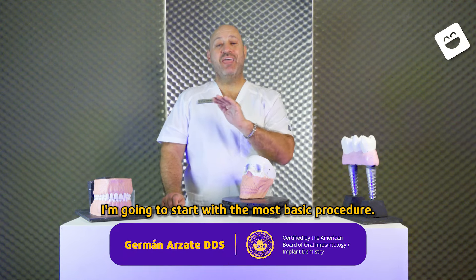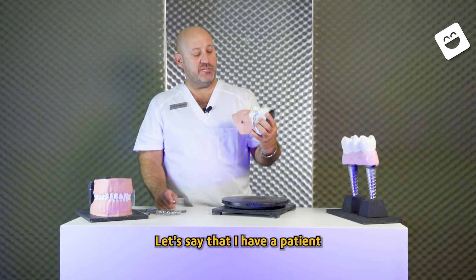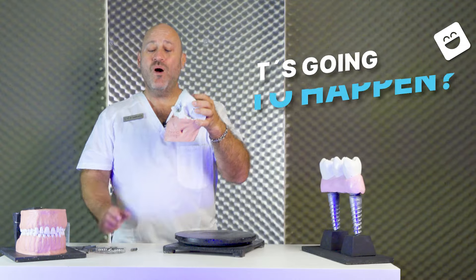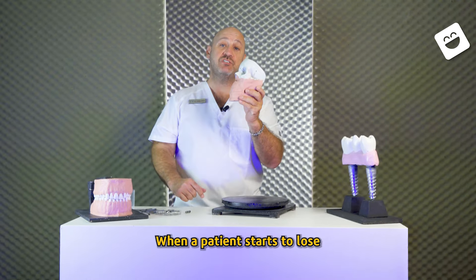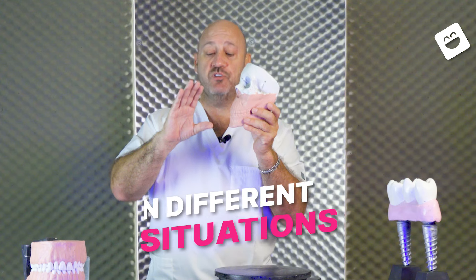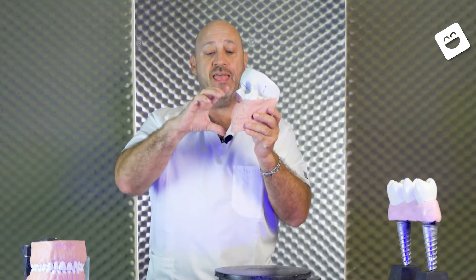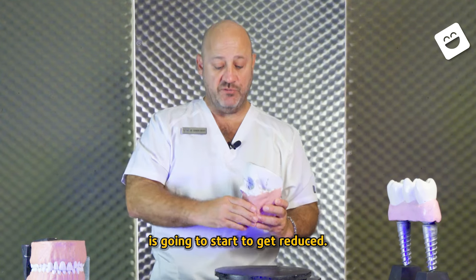I'm going to start with the most basic procedure. Let's say that I have a patient that has lost the teeth — here we still have teeth. The first thing we need to understand is when a patient starts to lose all the teeth, the body is going to react in different ways. The bone is going to start to recede, and the dimension from the nose to the chin is going to start to get reduced.